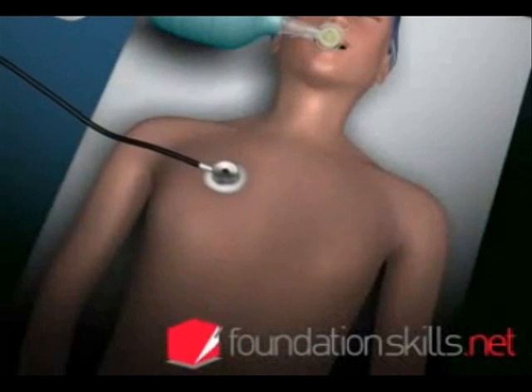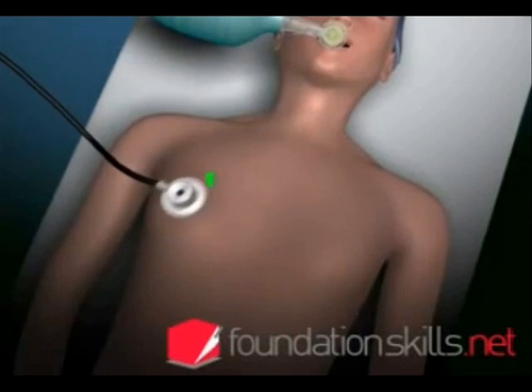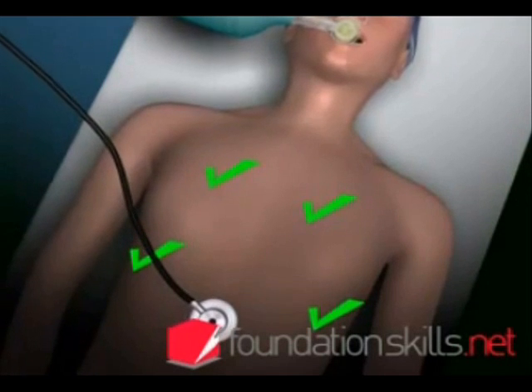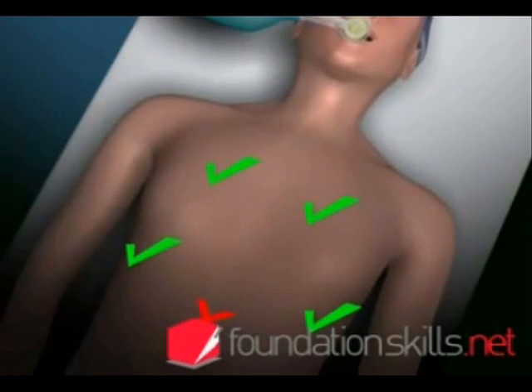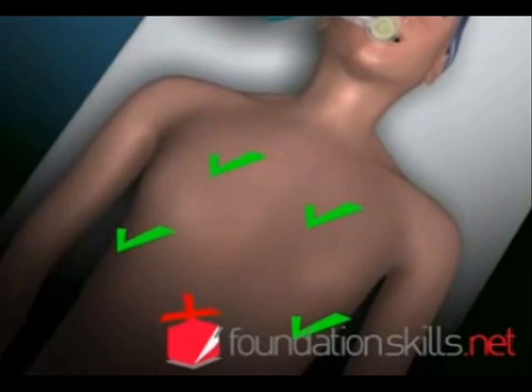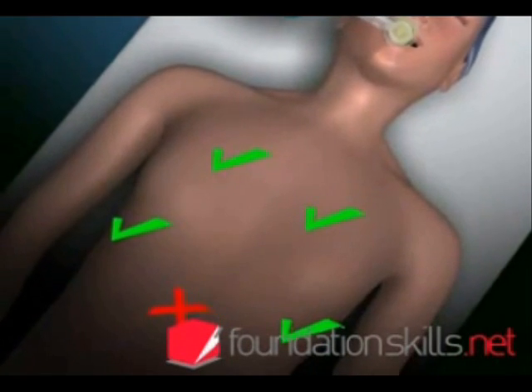Confirm the position of the tube by auscultating over the apices of the lungs, the axillae and the stomach. If it is not in the correct position, deflate the cuff and remove the tube. Resort back to bag and mask ventilation and repeat the intubation process from the beginning.